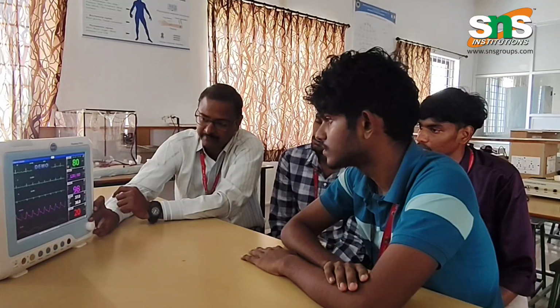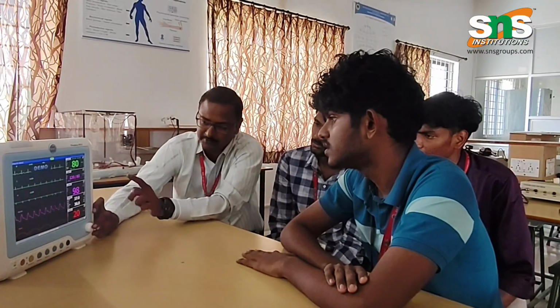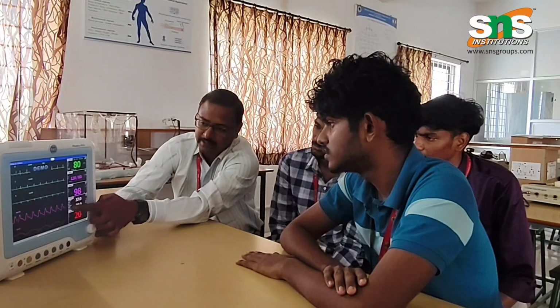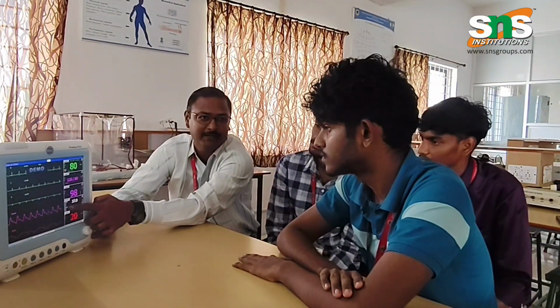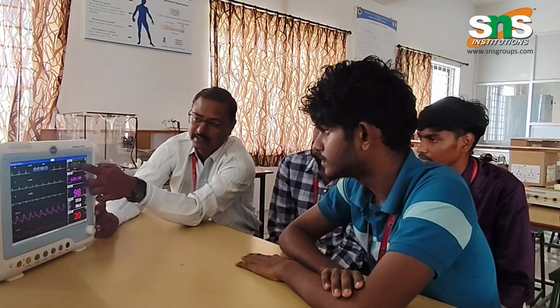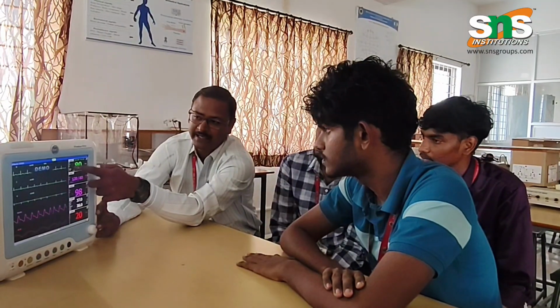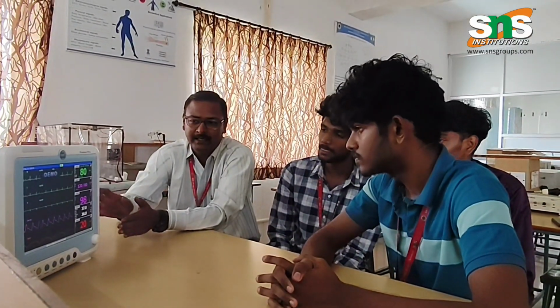Next we have one other important parameter called temperature. That is also the same. Here we can see the highest value and the lowest value fixed in this monitor. Next to the parameter, we can see the high and low levels fixed for the alarm indication. This is how a patient monitoring system is calibrated and tested in hospitals before it is attached to the patient.